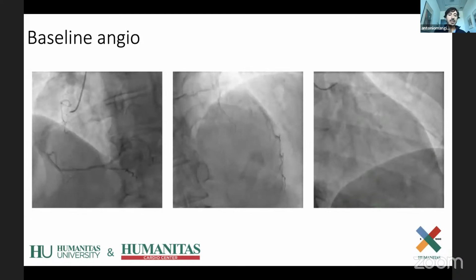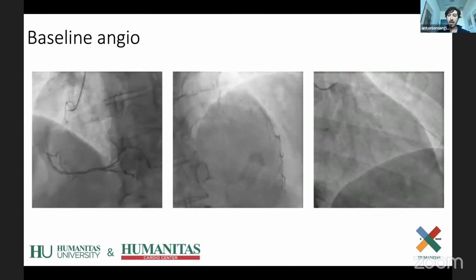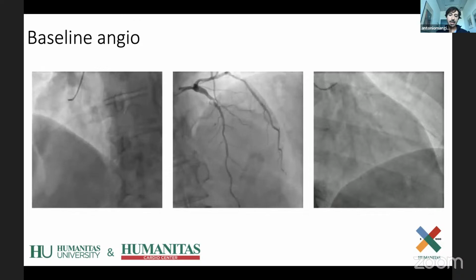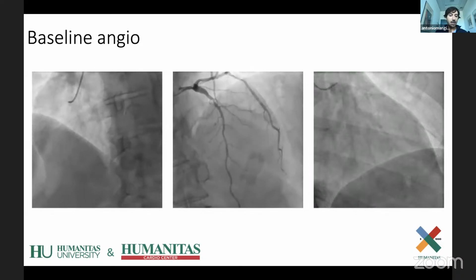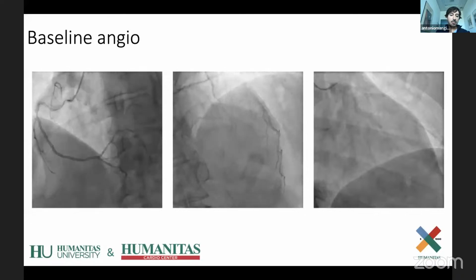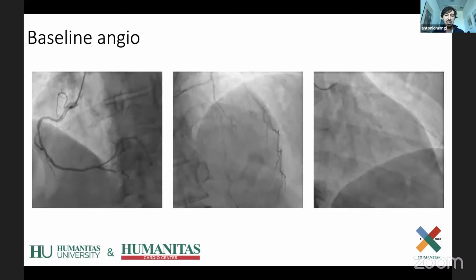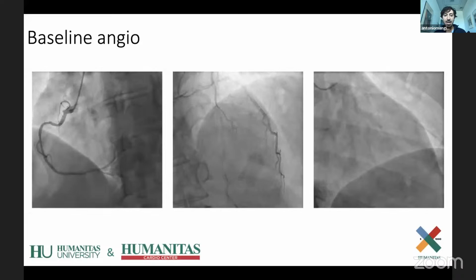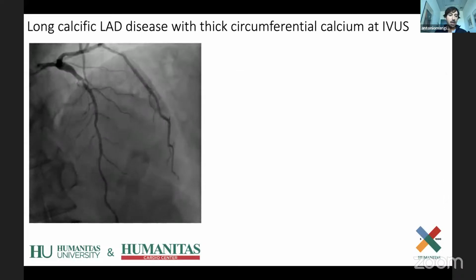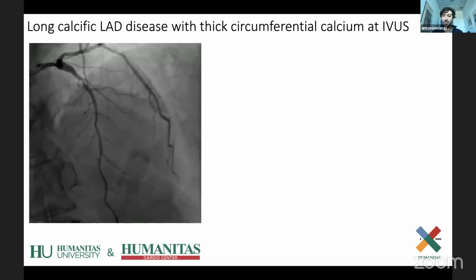While you see there is an intermediate lesion on the left main, plus I think a severe, clear-cut lesion at the level of the proximal LAD. Looking at the angio, my impression is that this LAD is moderately calcified. And I think that in this case, the best thing to do is to go for an IVUS.